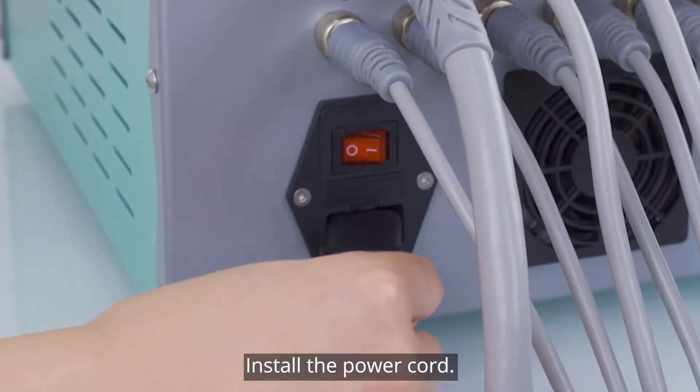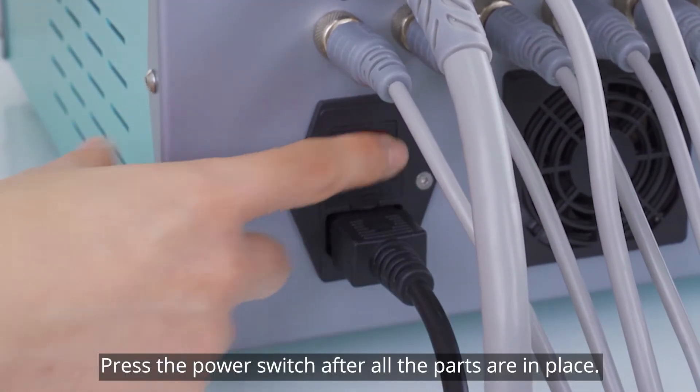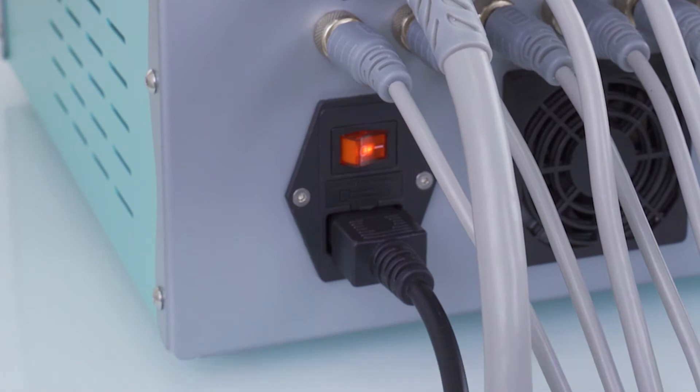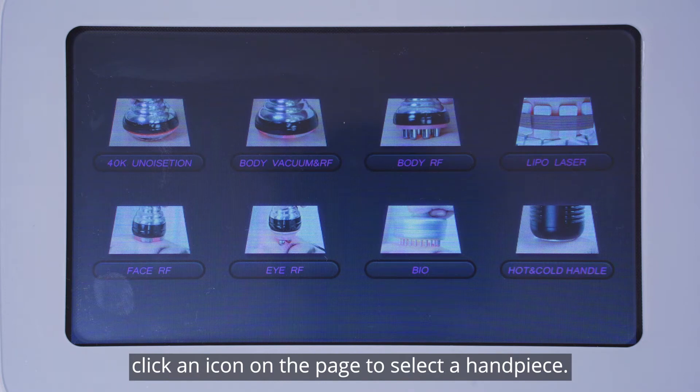Install the power cord. Press the power switch after all the parts are in place. Then the handpiece selection interface will show up. Click an icon on the page to select a handpiece.